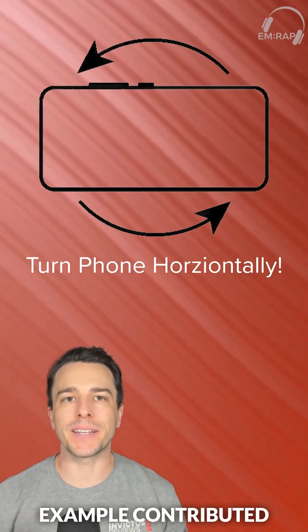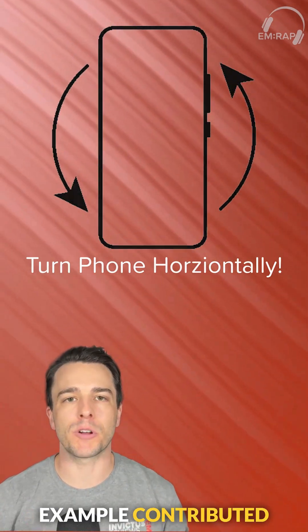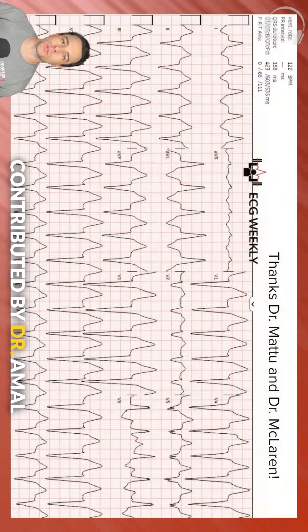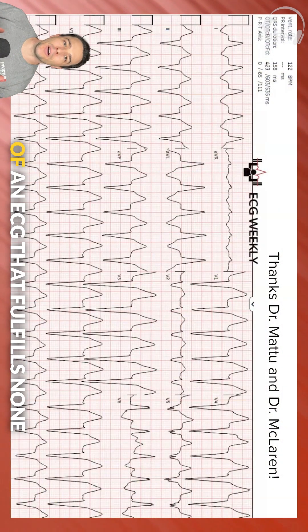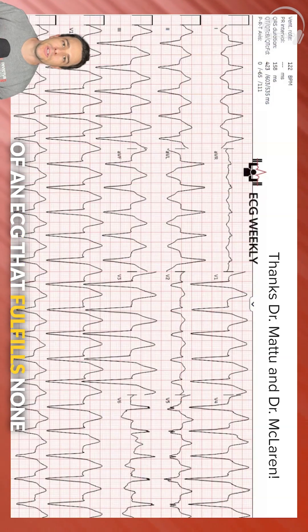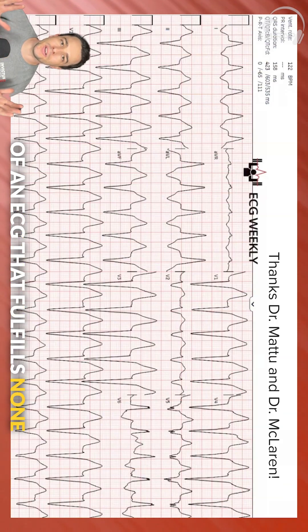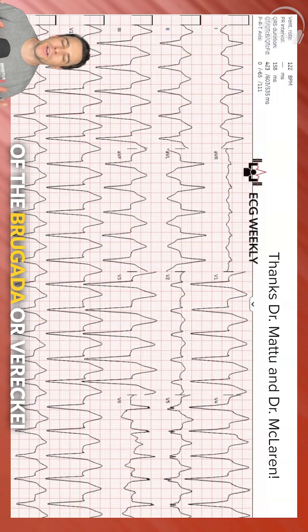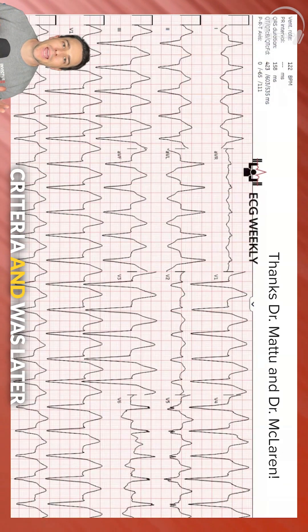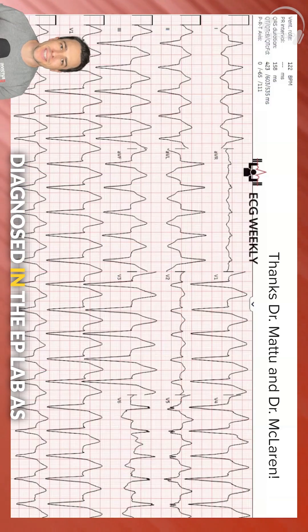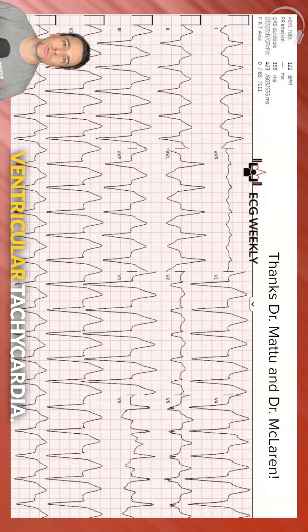Here is a perfect example contributed by Dr. Amal Matu and Dr. Jesse McLaren of an ECG that fulfills none of the Brugada or Varecki criteria and was later diagnosed in the EP lab as ventricular tachycardia.